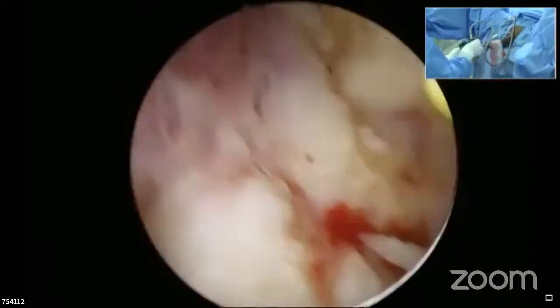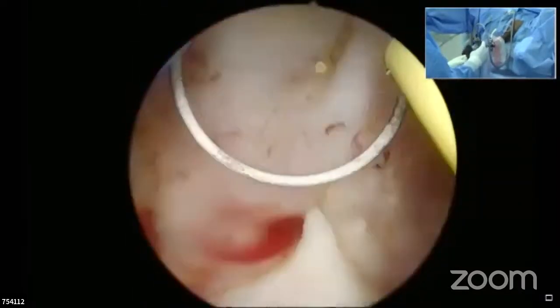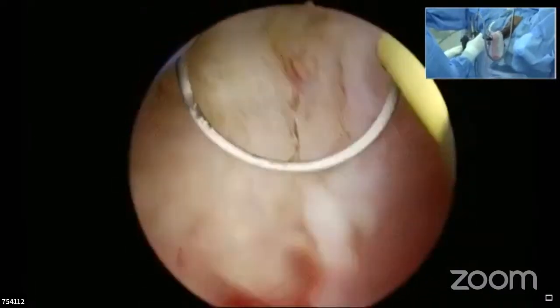Taif, are you ready to explain? Sorry? Taif? No, I'm asking Taif to explain, sir. I think he is almost done with the resection. Yeah, we can see it again. Go back and show us the endoscopic vision.